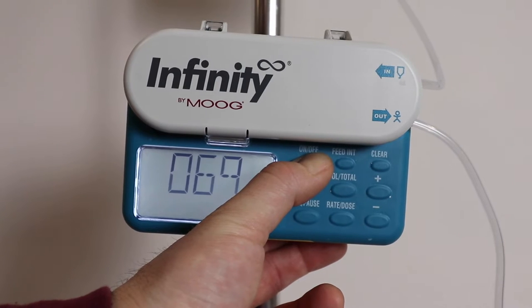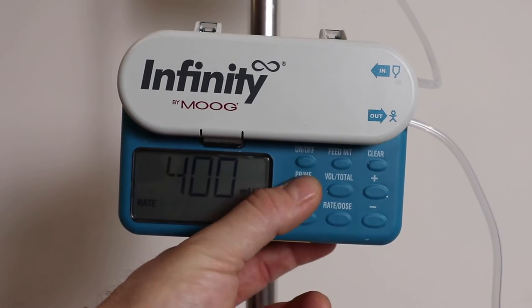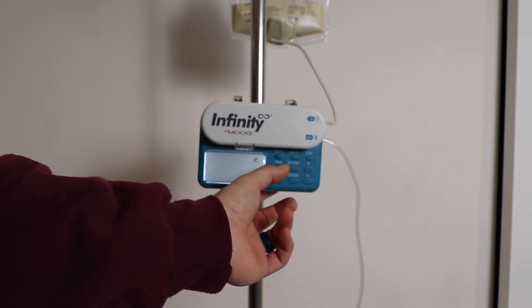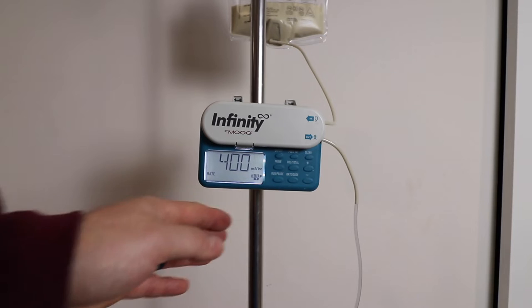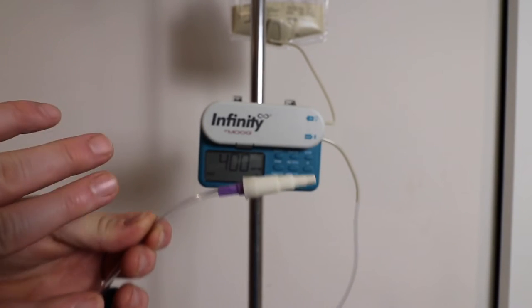Push and hold the on/off button until your machine turns on. Once it's on, it'll display the current rate that it's feeding at. Right here where it says 'prime,' you just hold down on that. As you hold down, you can see the formula going through the line — it's slowly pumping through — and you just hold that prime button down until it gets all the way to the very end and has filled up the whole tube.